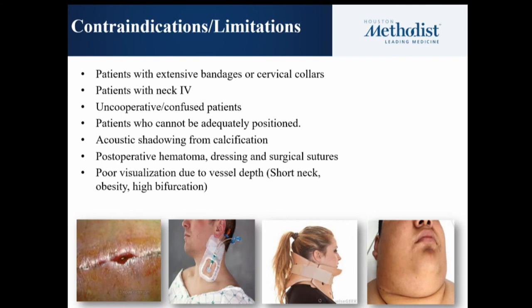Patients with bandages and cervical collars can present limitations and contraindications. IV lines, and any patients that are uncooperative or confused, can definitely pose difficulty. Of course, acoustic shadowing, not only from calcification inside the vessels, but also from surgical sutures due to gas being inside the tissue, can also prevent us from being able to see the vessel. Poor visualization due to vessel depth caused by a patient's body habitus, a short neck, obesity, or high bifurcation can also cause limitations.